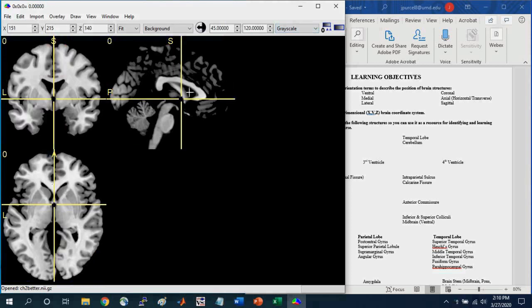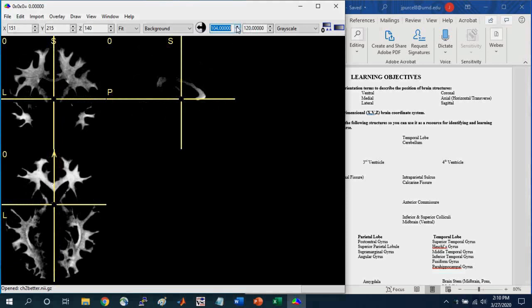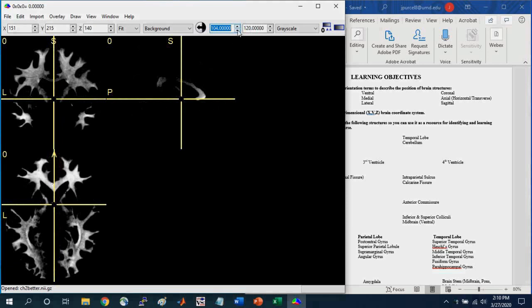Another thing to note with respect to the intensity values are these two values up here. So here this is the minimum and the maximum intensity value that you're viewing in this image.